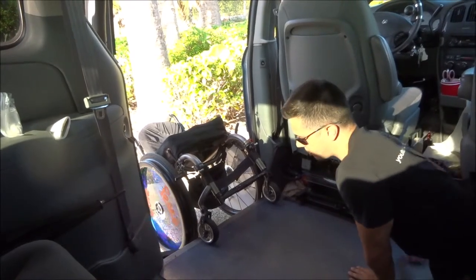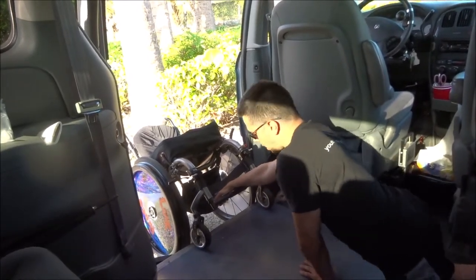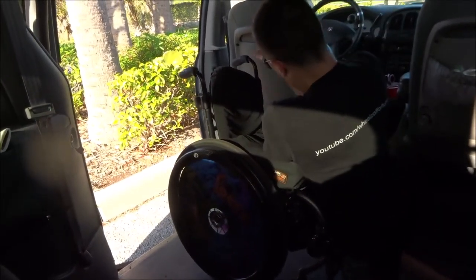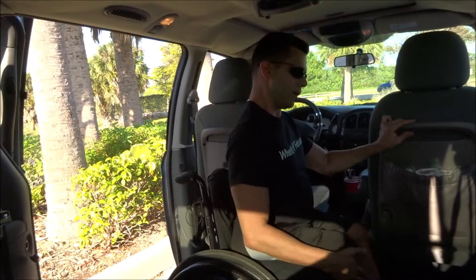This is a bit tougher than getting the wheelchair out because I'm pulling instead of letting it down. Hopefully I'll be able to do it on the first try — and there we go, I was able to do it. So now I sit in my chair, because unlike the first video when I transferred from the driver's seat directly to the floor, going from the floor to the driver's seat is very difficult, even for me. So I don't do that, just out of safety. So I'm going to close this door now.